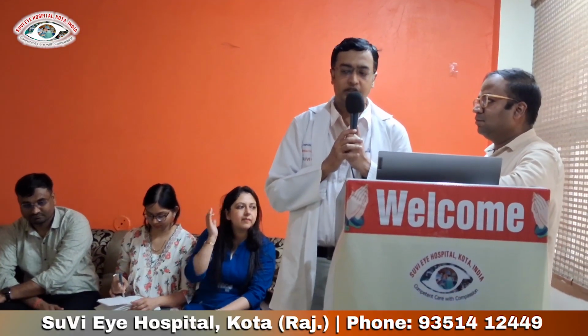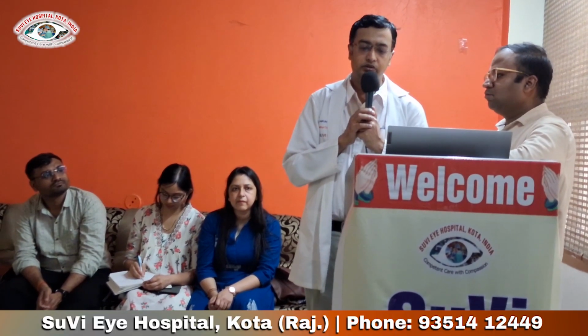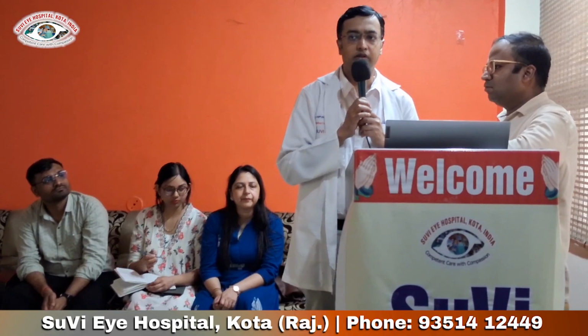After 3 months he comes with hyperreflective foci and disorganization of inner retinal layers with a deranged lipid profile. We check for lipid profile control and blood pressure control, and all the metabolic parameters are in control. Now he is a sort of chronic vein occlusion. So what will be your management options then?